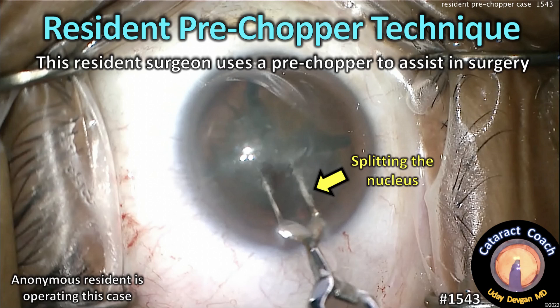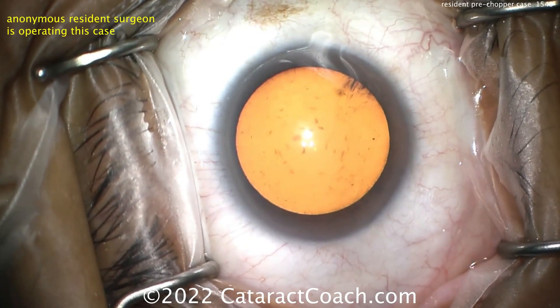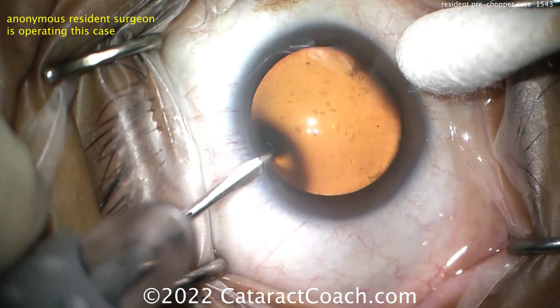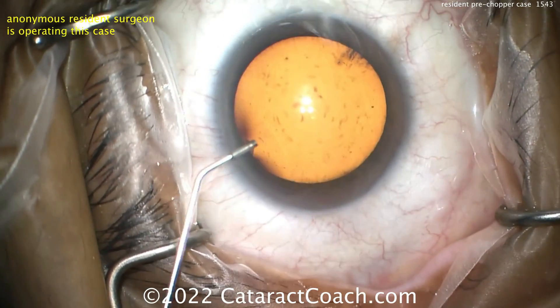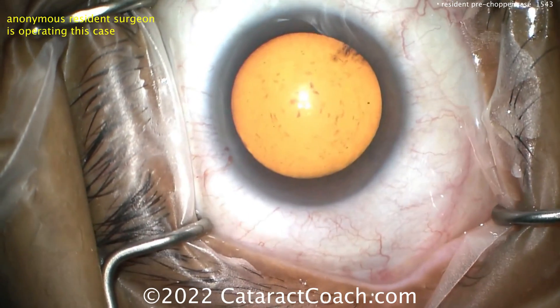cataractcoach.com — resident pre-chopper technique. The resident uses a pre-chopper to perform nucleofractis, breaking up the nucleus into smaller pieces. Good draping, good positioning, starting off for the case. The resident's question is: is it okay for this young doctor to primarily use the pre-chopper technique? We're going to watch that technique.